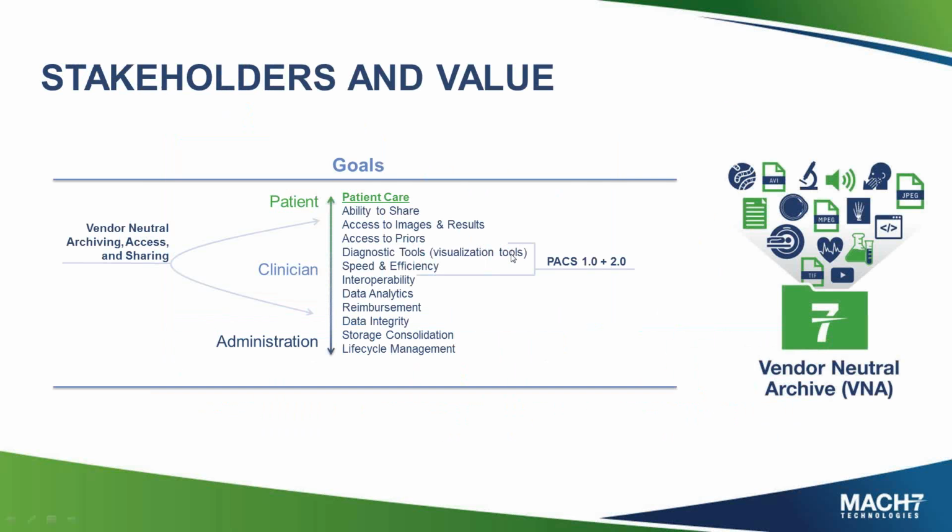And lastly in this little section, before we pause and take some more questions, is really around the stakeholders. This gets back into the history a little bit, but PACS 1.0 and PACS 2.0 had a lot of focus on the viewer and the diagnostic tools, and rightfully so. At the end of the day, we're all here to diagnose a patient and provide the best patient care. But we're starting to see that shift. How do we better manage the storage? How do we better manage the life cycle so we control storage cost? How do we make sure the data stays clean, data integrity? When my wife's name changes, I want to make sure that change is going to be on that image file for the rest of its life.